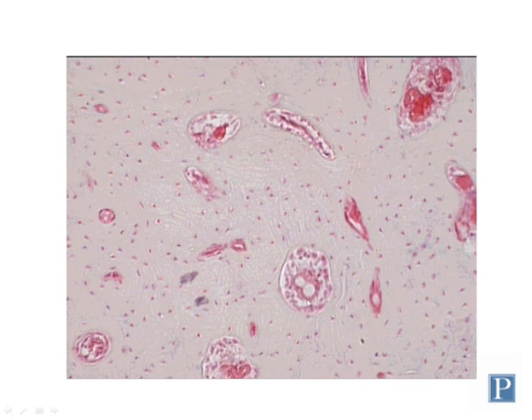The reason that you have different size haversian canals is that the younger the canals are, the larger in diameter they are. But as this bony tissue ages, the matrix becomes remodeled, and so you have new bony matrix laid over some portions of this canal which was exposed before, such that you get older haversian canals or central canals, which are more narrow in diameter. So the smaller the diameter, the older the central canal is.